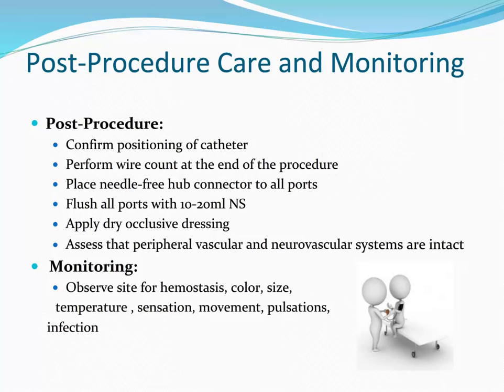Nursing must initiate a final wire count at the end of the CVL procedure, ensuring all wires used in the procedure have not been retained. Be certain that needle-free connectors are placed on all ports and are flushed with 10 to 20 cc of normal saline. Place a dry, occlusive dressing. The Primapore frame dressings can be found in the procedure cart and a CVL dressing kit.